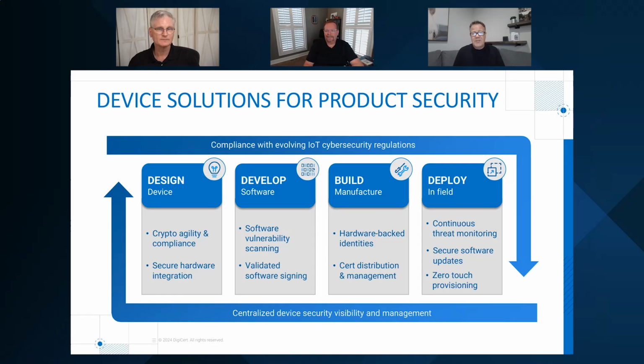Yeah, that's a great question. And utopia, what does utopia look like? So most medical device manufacturers will never get to utopia, but in a perfect world, we'd see security in the design phase early on. Security being thought about when you're selecting the hardware. Does that device have a secure element, a trusted execution environment, a TPM, something where secrets and keys can be privately and securely stored?